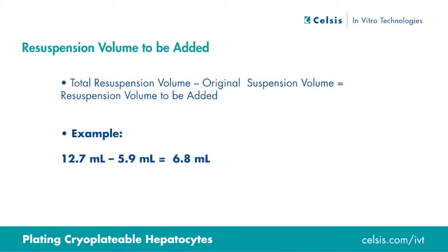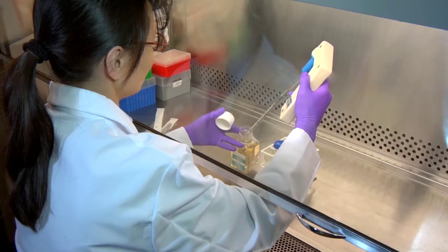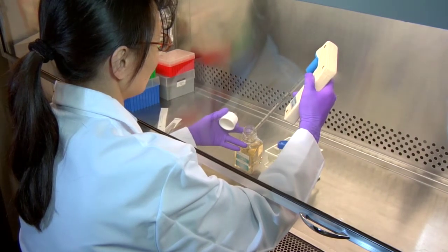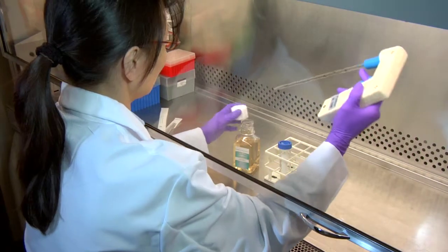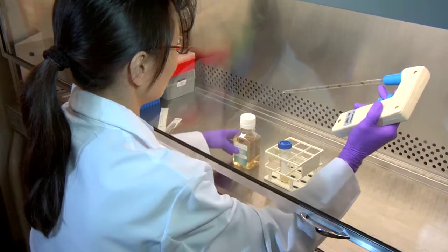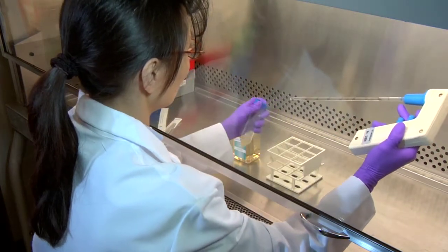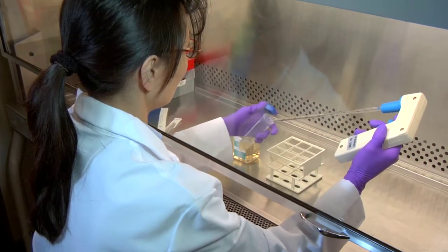Continuing our example, the original suspension volume of 5.9 milliliters must be subtracted from the total resuspension volume of 12.7 milliliters in order to determine how much in vitro growth CP media needs to be added to bring the total volume up to 12.7 milliliters. To the conical tube of hepatocytes, add 6.8 milliliters of in vitro growth CP media. The final cell concentration will now be 0.7 times 10 to the 6 viable cells per milliliter.